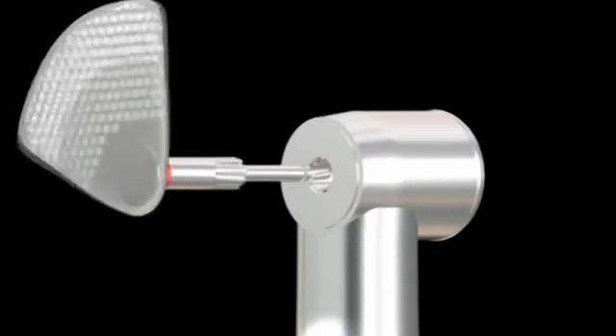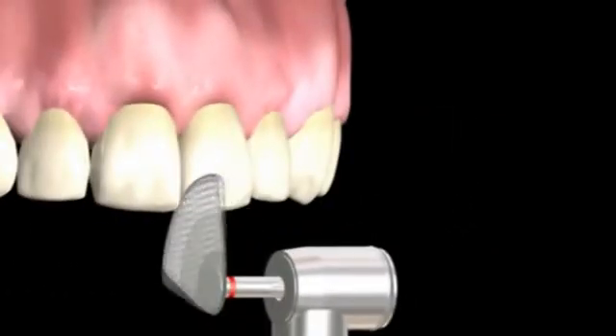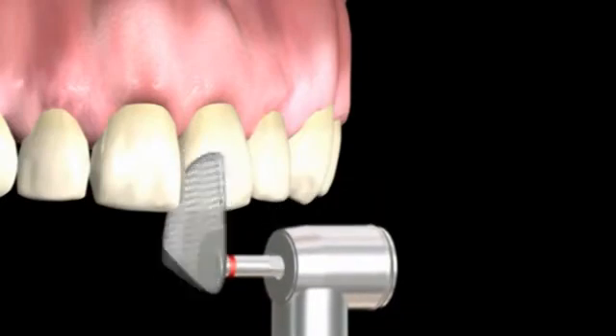Engage the handpiece before doing interproximal reduction. The oscillating angle of the discs is 30 degrees — 15 degrees in each direction.